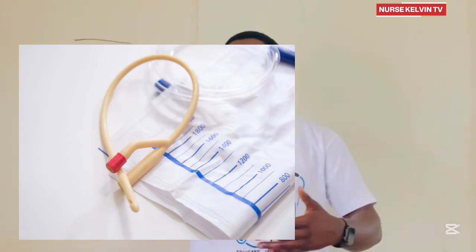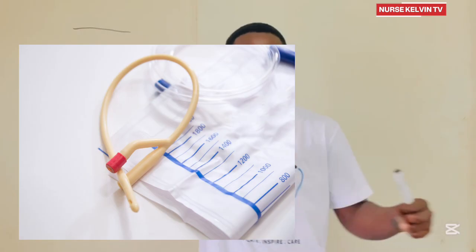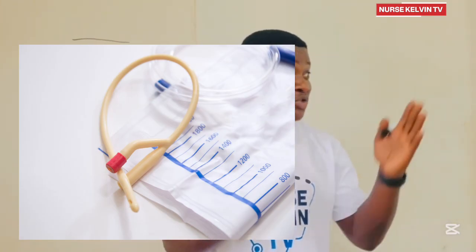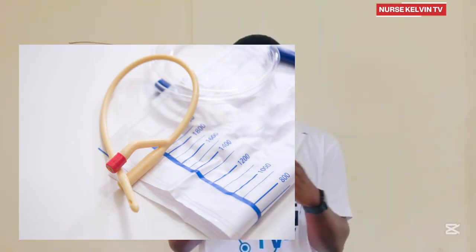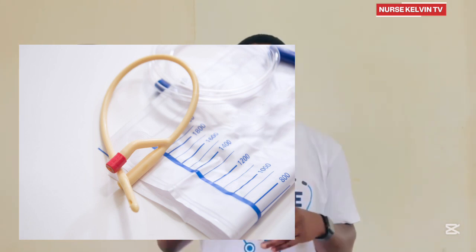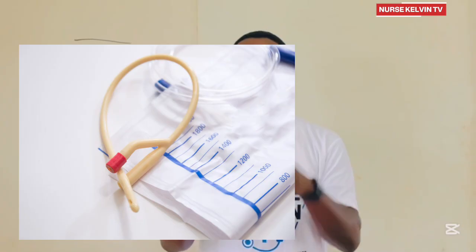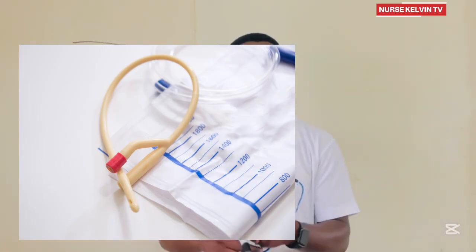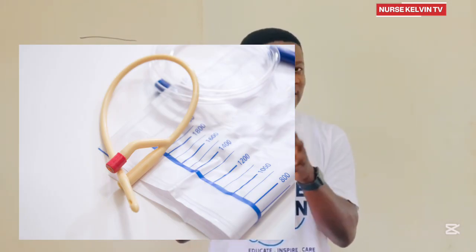Then the next one is the urinary catheter. They always say, oh, catheter. Please, the catheter is used for a purpose. Most of us think the reason why a patient needs a catheter is just to urinate, but you use the catheter to measure the urine output. This is going to help us to know whether there is renal failure or an imbalance in the body. So please, get to know these devices.